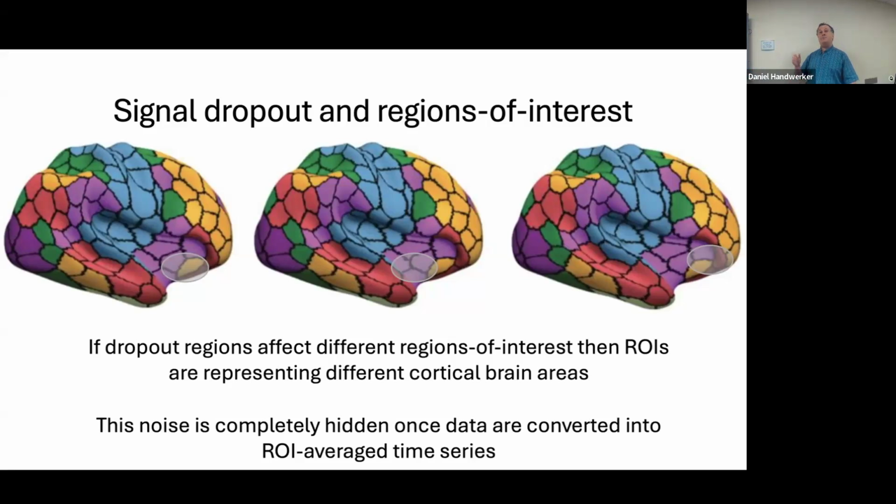Or I think what happens more often is you download a data set that whoever collected the data was very happy with, but they didn't care about the amygdala. And you care about the amygdala, so you have to give it a good hard look and say, I can't use this data because they did not get reliable amygdala signal.